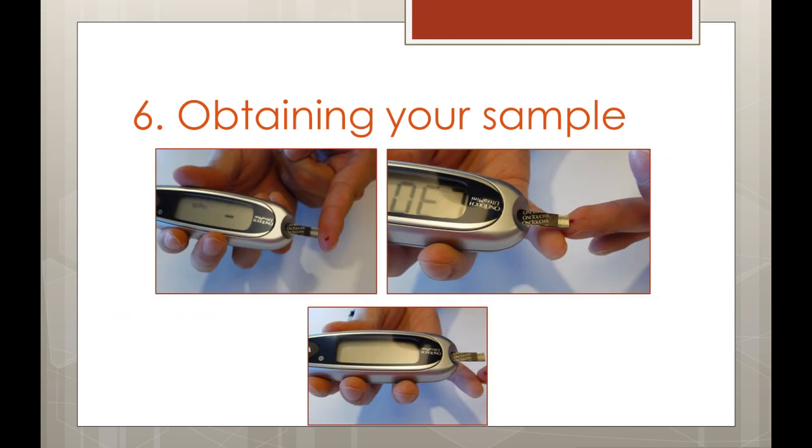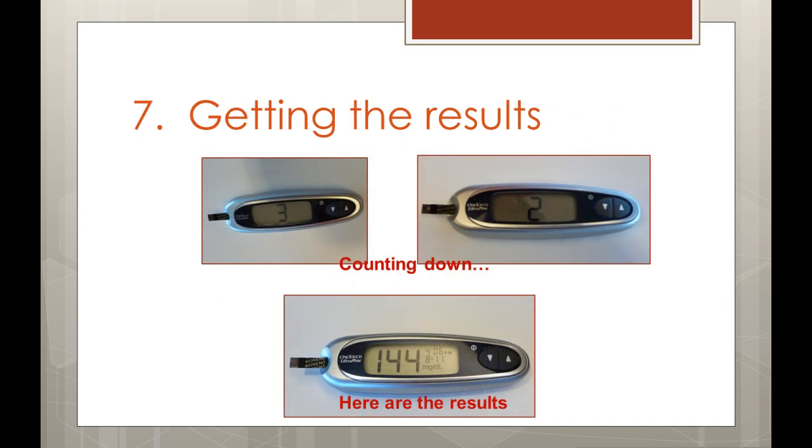To collect your sample, line up the narrow channel on the test strip in the meter to the edge of the drop of blood, and gently touch the channel to the drop. The blood will be automatically taken up into the channel. Wait until the entire channel is full and you hear a beep or see a countdown. Move the test strip away. After a few seconds, your results will be displayed on the screen.